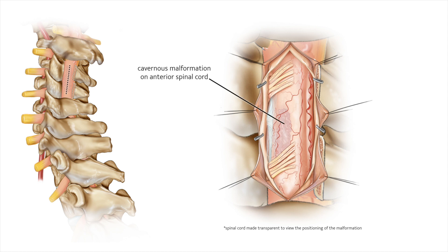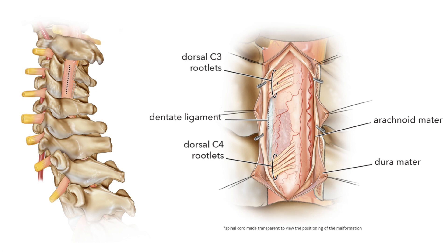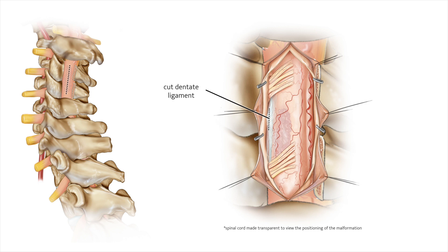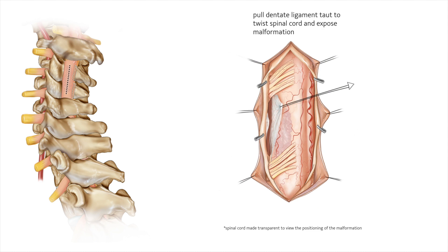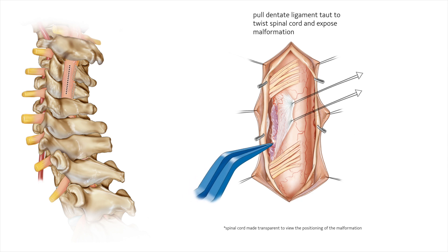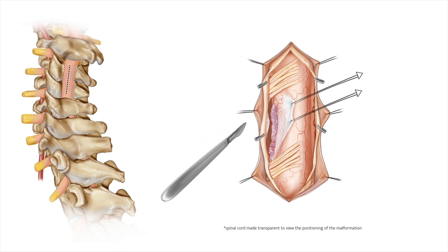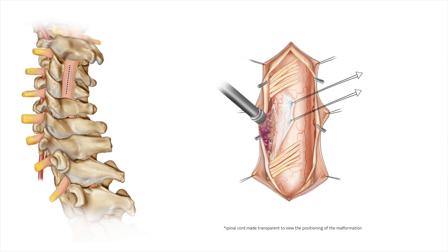In this case, the dura, or outer protective layering of the spinal cord, has been opened in a linear fashion and retracted using small sutures. Deep to the dura is a thinner translucent layer of protective tissue known as the arachnoid, which is similarly opened and retracted to the side using small metal clips that are removed at the conclusion of the procedure. This exposes the dorsolateral cord, including the dorsal rootlets of C3 and C4. Because the cavernous malformation is on the ventrolateral aspect of the cervical cord, the dentate ligaments must be cut and placed under gentle traction to expose the ventral belly of the spinal cord and the cavernous malformation itself. With even a small window, we may carefully and safely enter the spinal cord and remove the cavernous malformation using gentle suction and meticulous dissection with minimal use of cautery to avoid damage to the healthy tracts of the spinal cord.